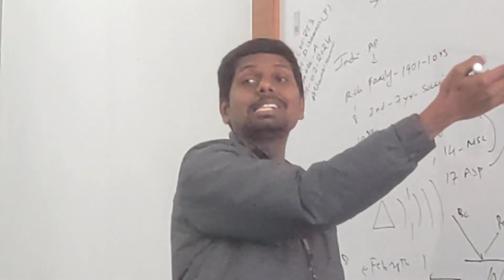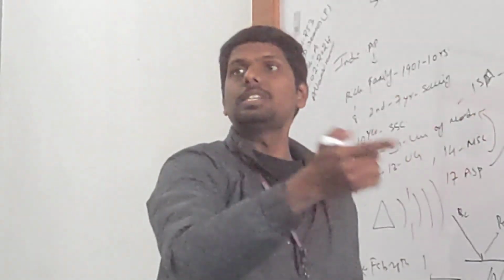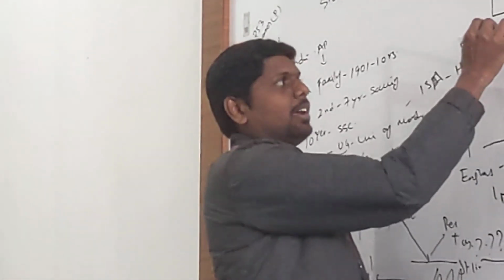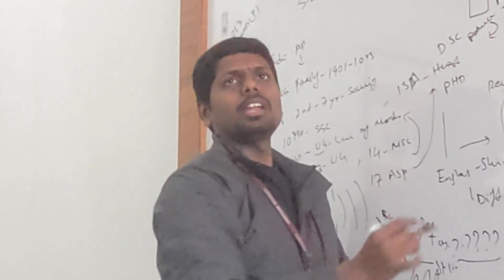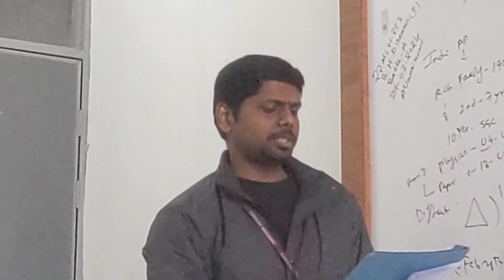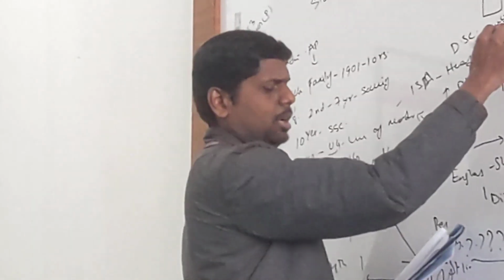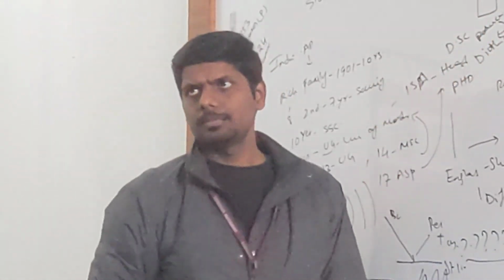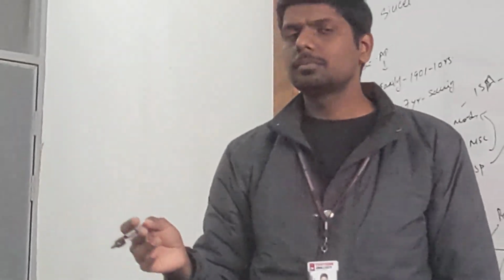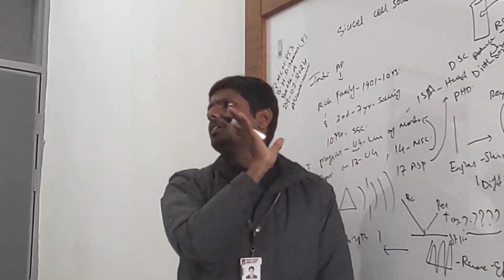Am I correct? That is what sickle cell anemia is, right? Removal of oxygen will turn Hb to sickle shape. Do you remember? Right. So here I will add a reducing chemical, redox reaction. That redox chemical is dithionite. Dithionite is the reducing chemical. Anyway, it will remove oxygen from the sample.